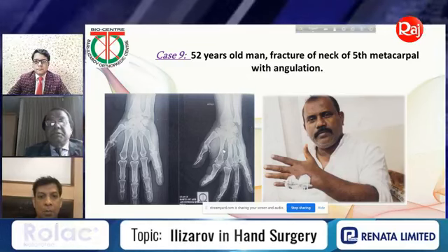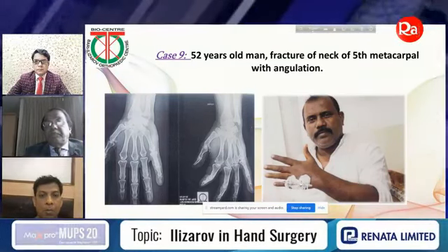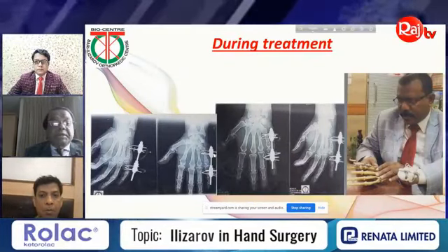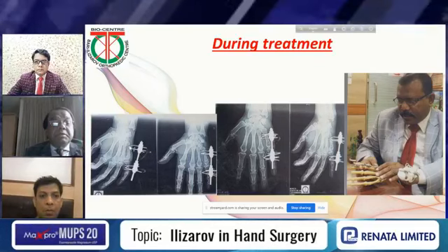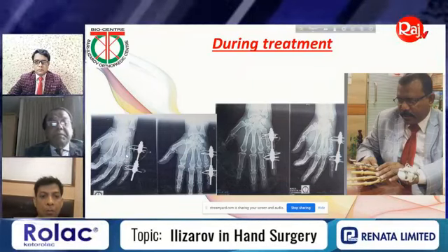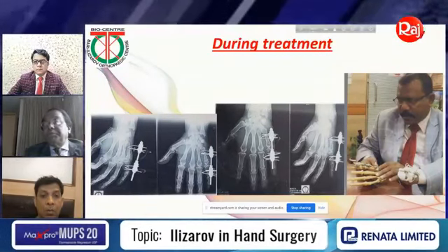And then you can correct easily whenever you put the mini Ilizarov fixator. You can see here, this is what I have done. Many two wires here bending. This is bending. You have corrected the angulation. This angulation is corrected, and the patient and teacher are happy.